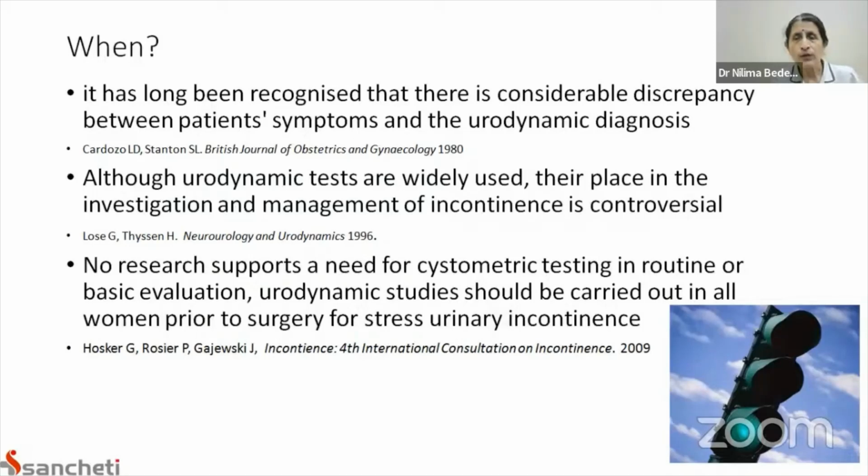This is going to cause considerable distress. There are chances of getting infection after this. The psychological stress the person undergoes during the testing, and the psychological status, can influence the bladder behavior and the urethral closure pressure. So there should not be any infection during that stage. There should not be any other problem during the urodynamic test being carried out.